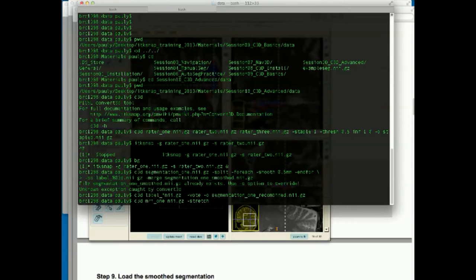So it's the same thing that you're doing here, and Phil showed you the stretch command. You're taking 0 to 98% here and putting them into the range of 0 to 255, and then getting rid of anything that's outside of that range with clip. This is exactly what the auto command does. When you go in SNAP and you go to the contrast window and you hit the auto button, it does exactly what Sandy just typed in.